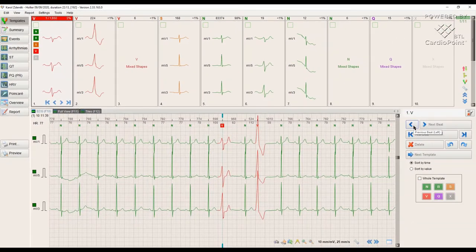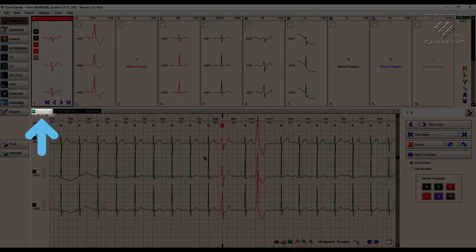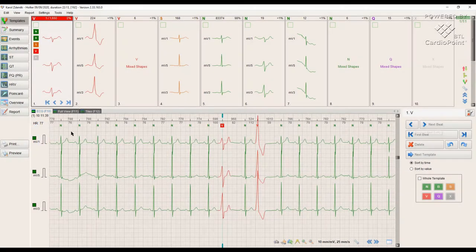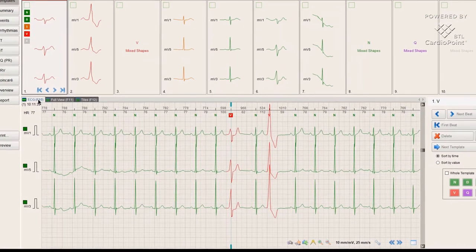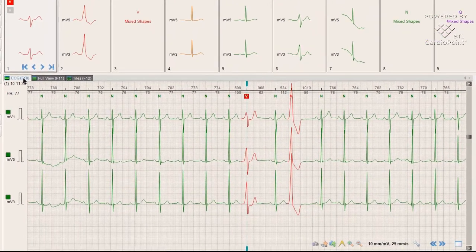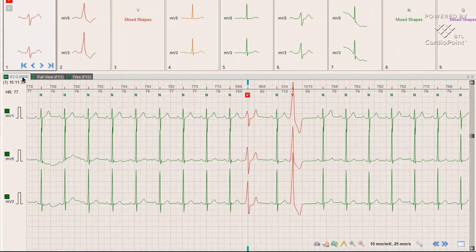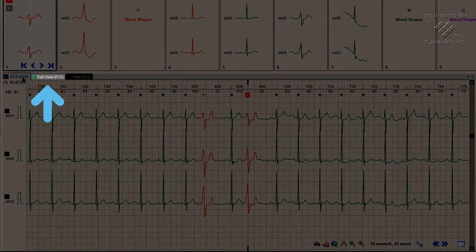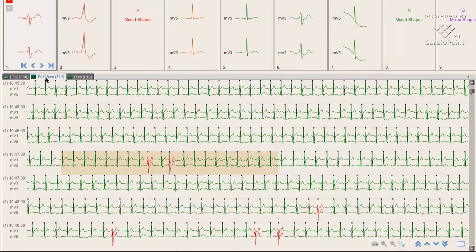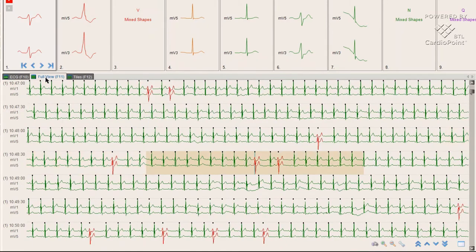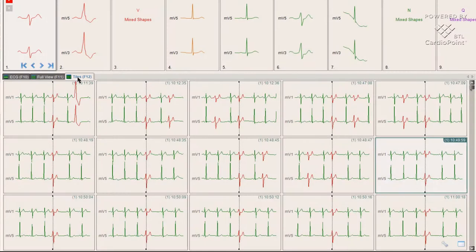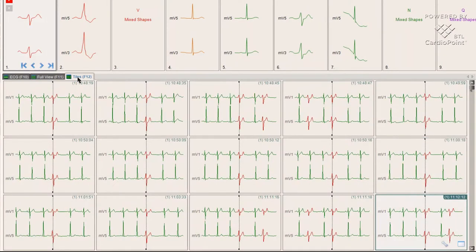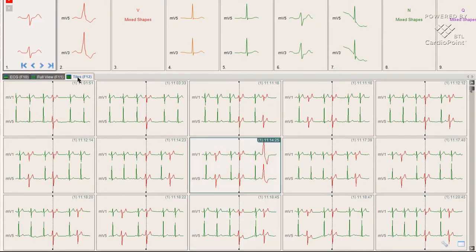To work with the template, we can choose ECG view, full view, or tiles view, which is the best solution for a large number of beats since it allows us to see several contractions simultaneously.